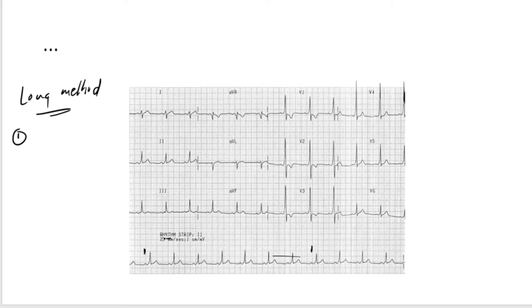Every ECG that you get, at the bottom here, they will always have an elongated lead, which is lead two, actually. Lead two, it's an elongated format which we call a rhythm strip. Now, the long method dictates that you count 30 big boxes.